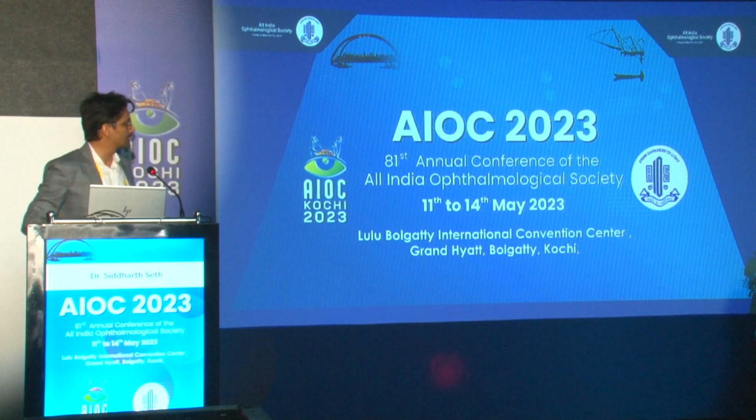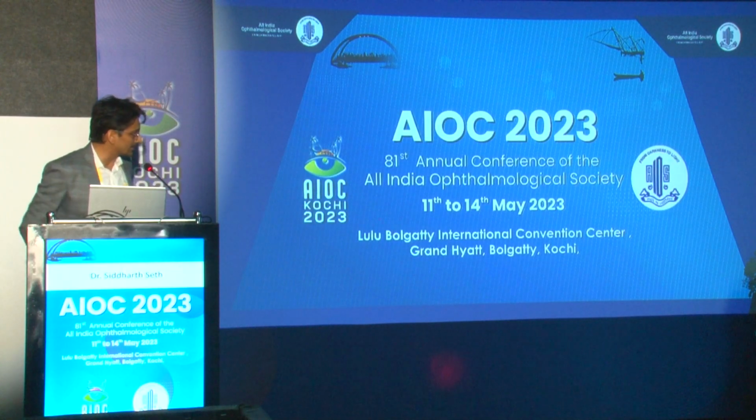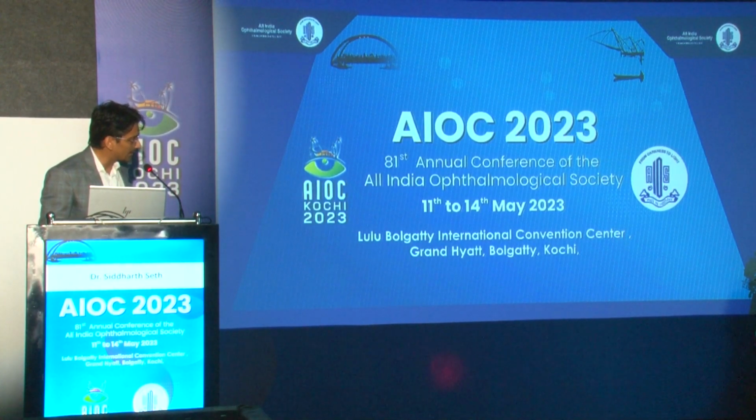In your study, you compared with an Eye Trace the internal aberrations. Yes, sir. And what was the maximum astigmatism that you had calculated? So we excluded astigmatism of more than 1.5 diopter, sir. Any patient with preoperative astigmatism more than 1.5 diopter we excluded. Below 1.5 diopter we used toric lenses in those cases.